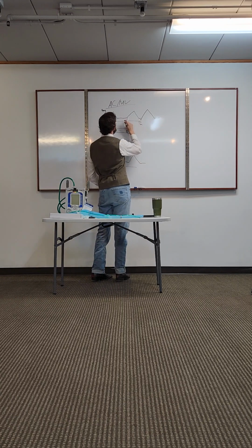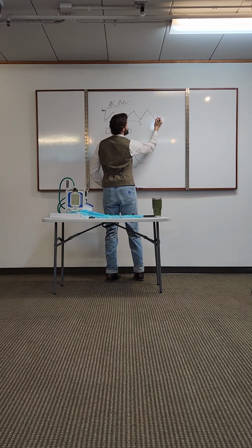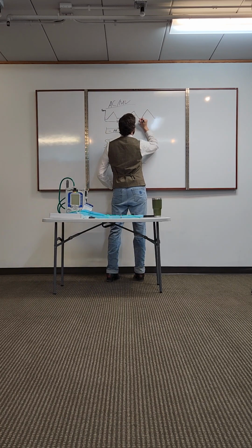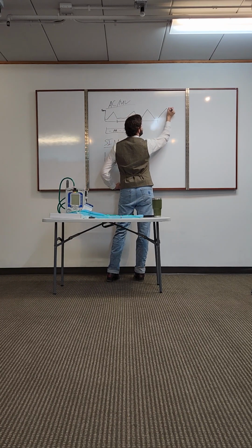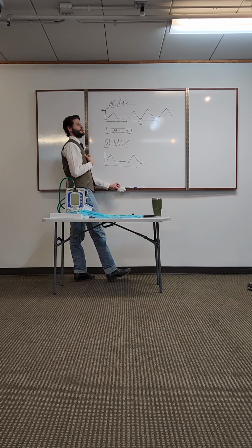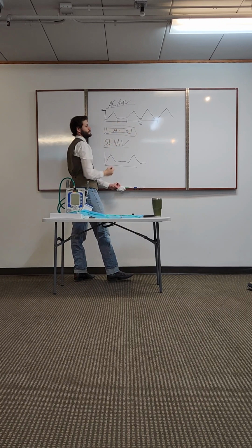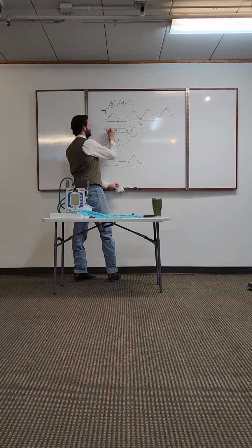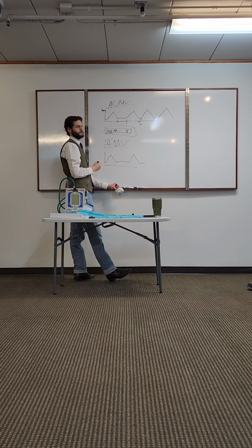And then once it reaches this distance from here, it will initiate its next breath. So you could end up with almost a breath stacking. So the whole point of it is that if a patient takes a breath in ACMV, it's going to give them whatever it is that you set here. So if you set the tidal volume to 450, it's going to give the patient 450, even though I might try to breathe on my own.